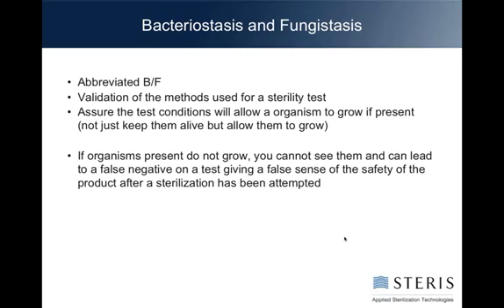So you may have more confidence in your results than you really deserve to have, because you could have organisms present that are alive and that when they're put in a different condition will grow, but in your test they did not.